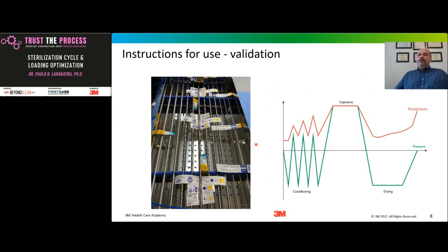And believe it or not, when I was doing this process, I learned that when we challenge one device, when we only study a device, we are not comparing what we see in our daily hospital practices. When a medical device manufacturer validates their instructions for use, they are using a sterilization cycle that has to be identical to the sterilization cycle that you have in your hospital.